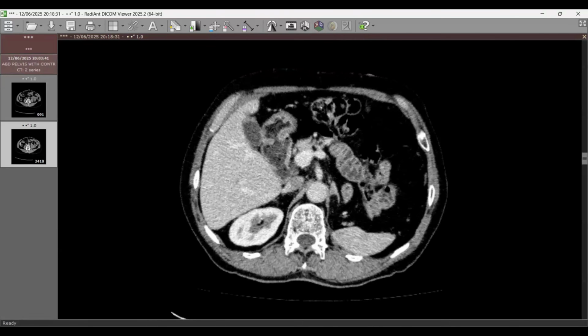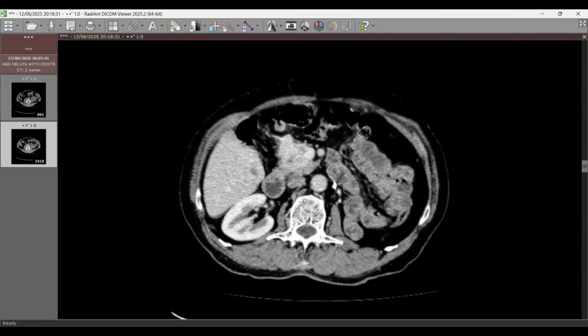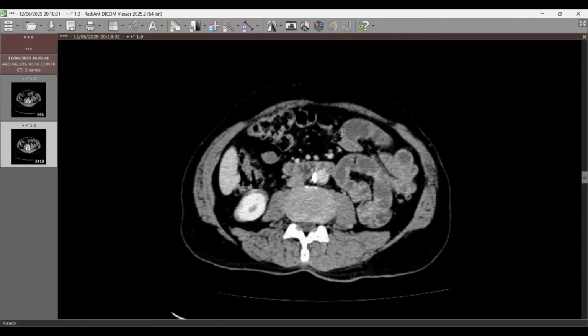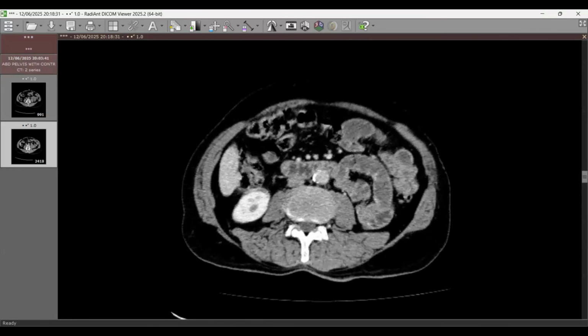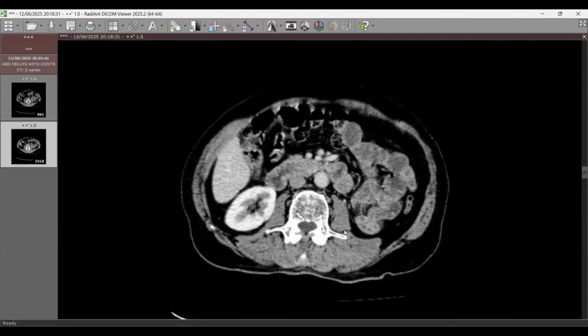Your feedback, Dr. Saab, with the observation, I'm afraid I'm going to give you, I don't know the terminology, borderline fail, but poor, I guess. Why? Because there was an important thing that you had to identify in this case, which was the left kidney, which is not there.